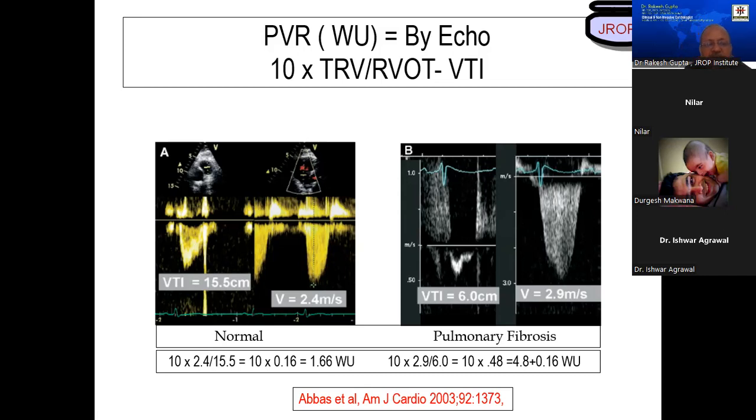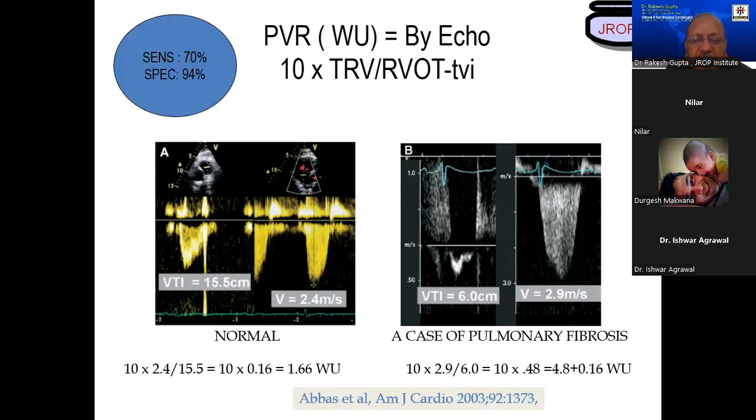Is that clear? Because this is how we look at various things in day-to-day practice. Anything more than 3 is considered abnormal.